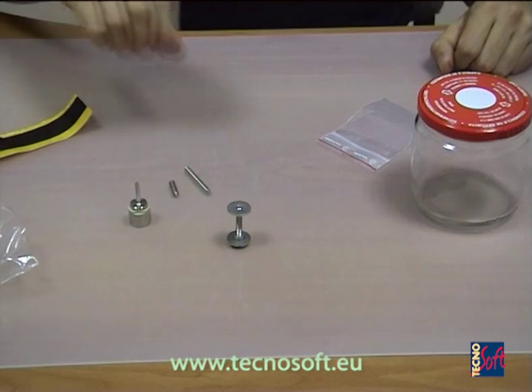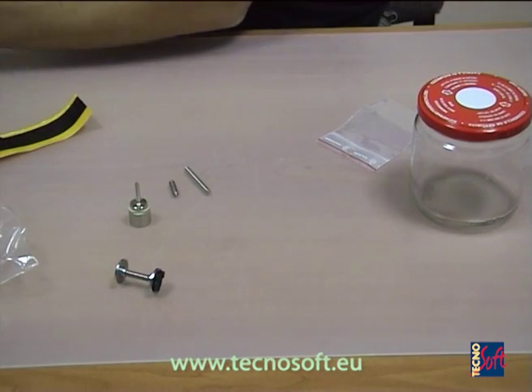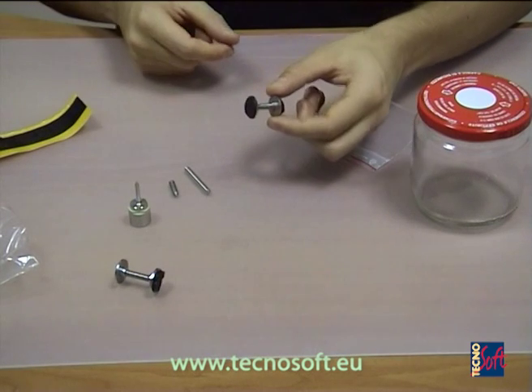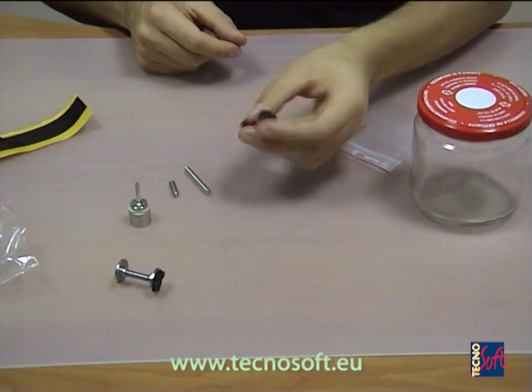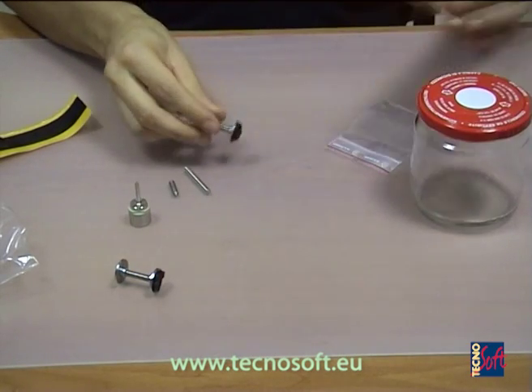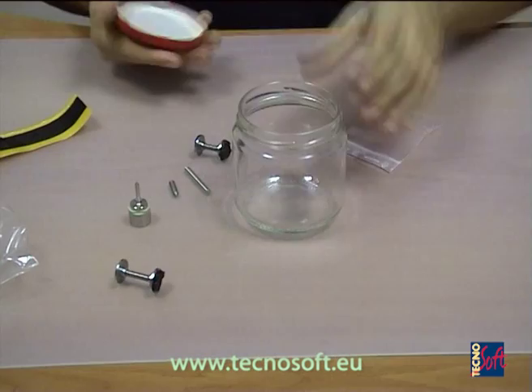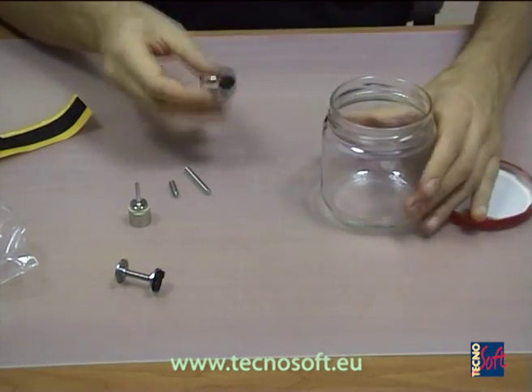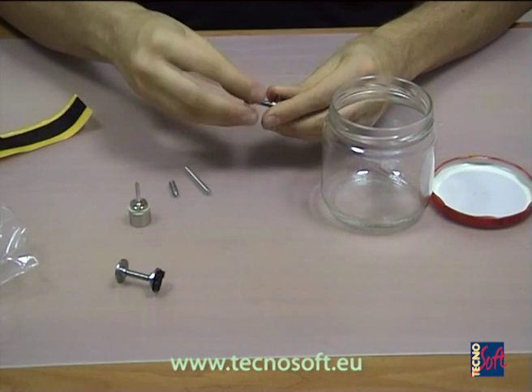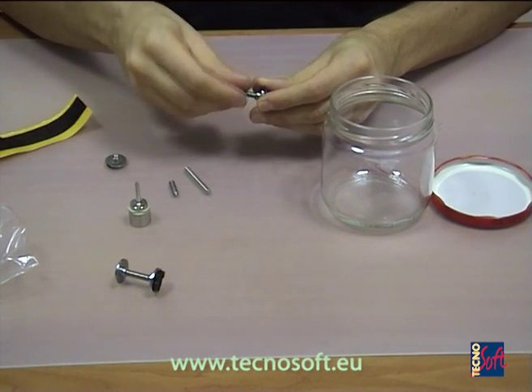Now we are going to place an S micro logger inside a jar — in this example a jar filled with a solid or semi-solid product. The tip of the probe, which has the sensing point, must stay at the center of the jar. We must use the proper pivot; in this case, the one centimeter pivot.